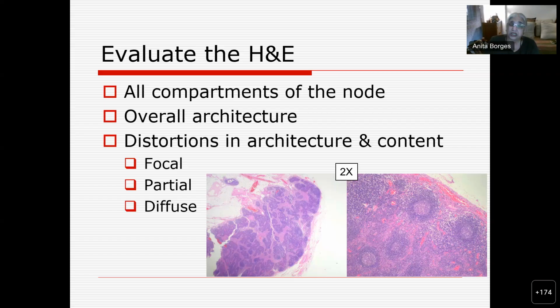If you ever see one like that, you are very lucky, because the lymph node is an organ which is in different states of physiological reaction, because it is plastic. A lymph node does not remain the same from day to day, moment to moment.